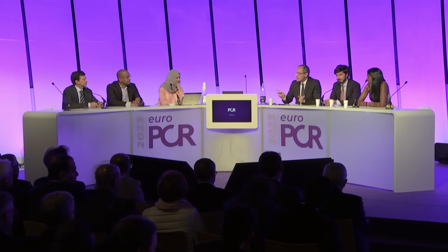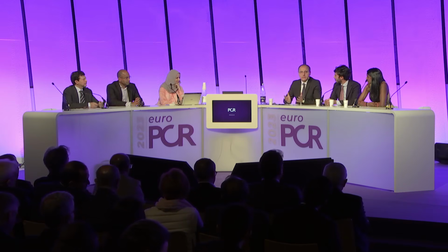Before I move on and I ask here in the panel, based on the information we have acquired so far, what would be the next step? What would be the strategy to adopt in these patients? We already heard what will be the strategy from the operators in Toulouse. But let's hear in the room what is your preferred strategy. Now you know what is the angiography, you know what is the IVUS. Who of you would go right away with a rotational atherectomy? Please raise your hand. Let me see that.